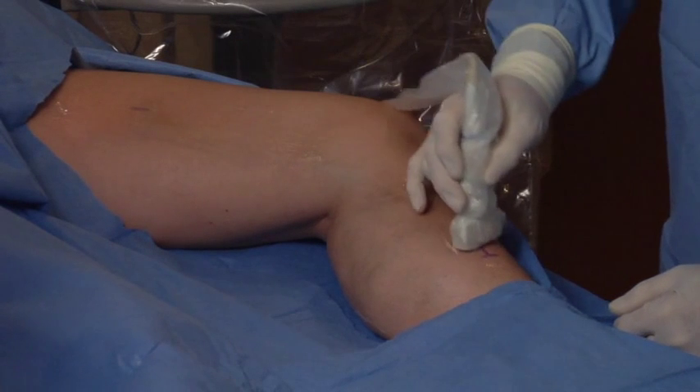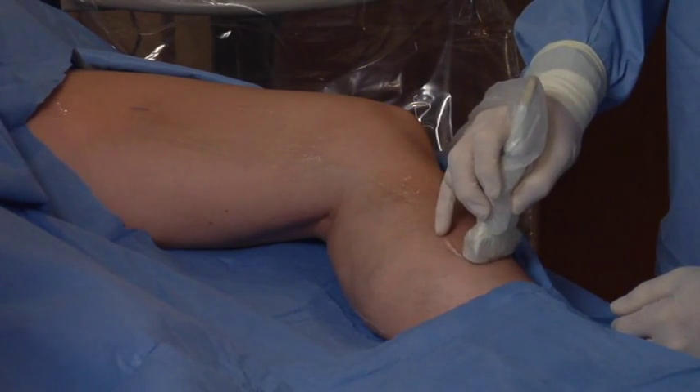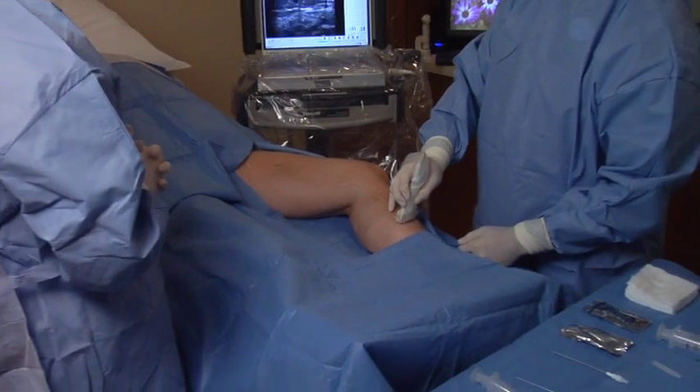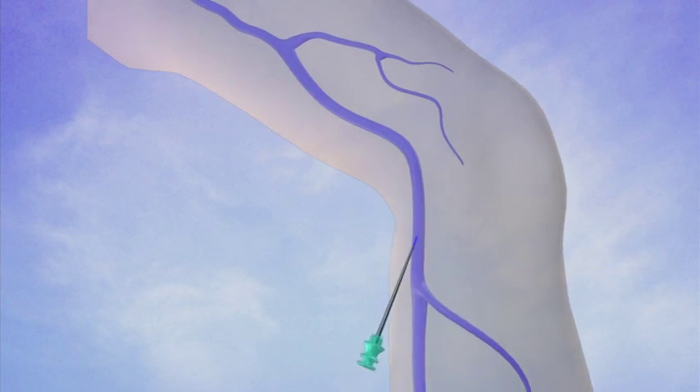Your leg will then be prepped and draped in a sterile fashion to minimize any risk of infection. A small needle is then inserted, generally just below the knee.